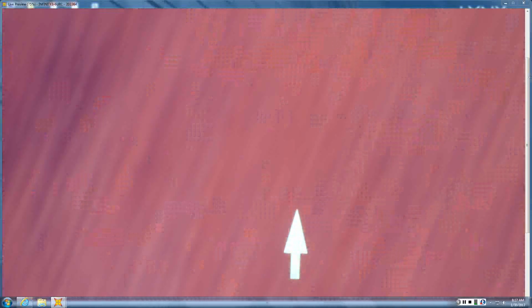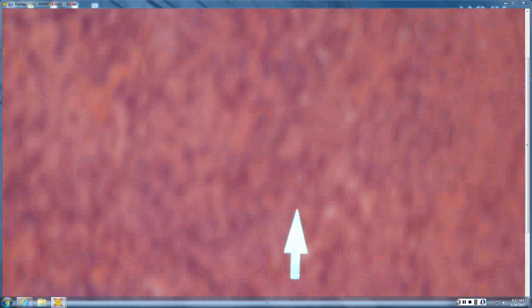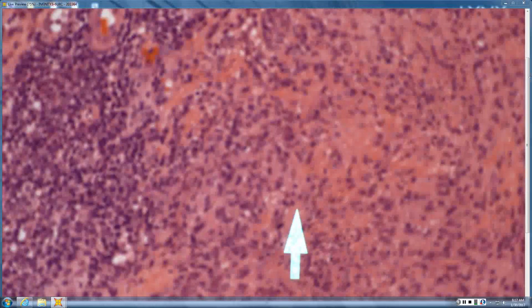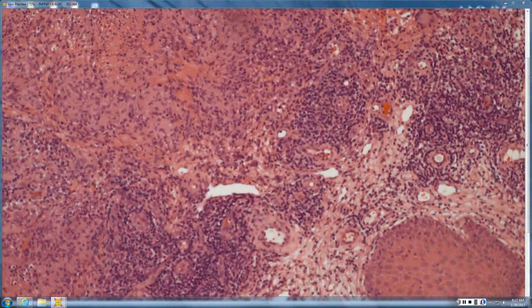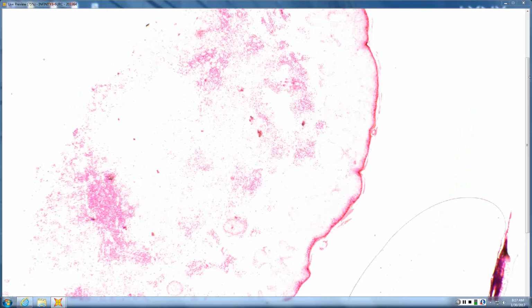If we look in the dermis, I'm seeing some circles. I'm not seeing a lot of organisms in there. Mm-hmm. But you're definitely going to want to work through that differential, and for leish, one of the clues might be the plasma cells, which leish loves just as much as syphilis does.